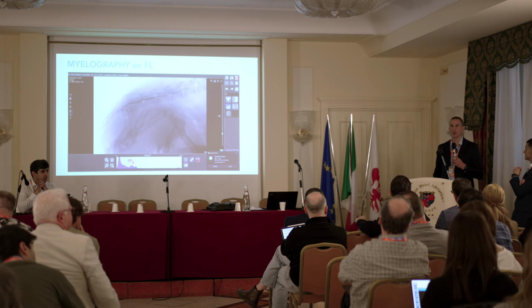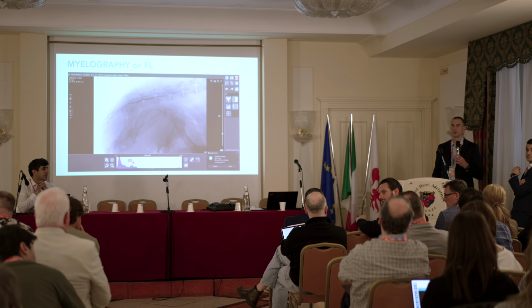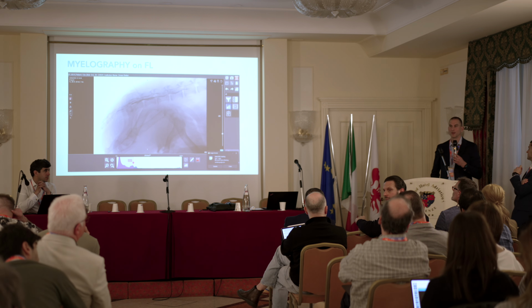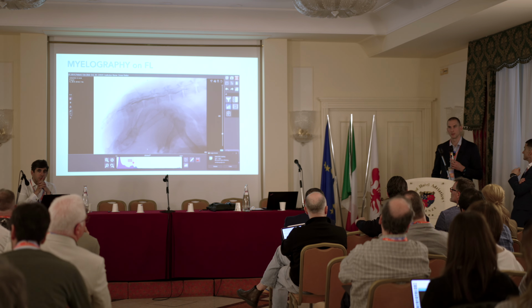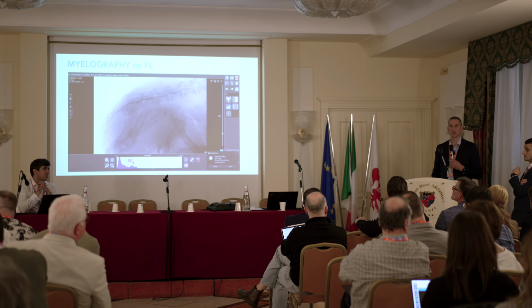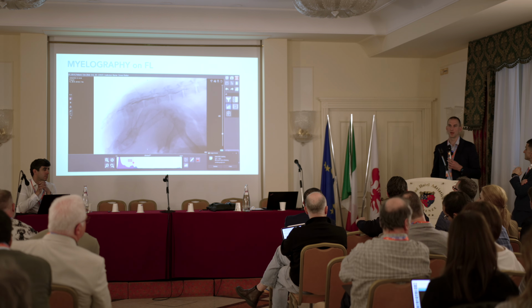This kind of herniation I never saw after myelo. So okay, there are some degenerative, hereditary problems, but this I don't have afterwards.